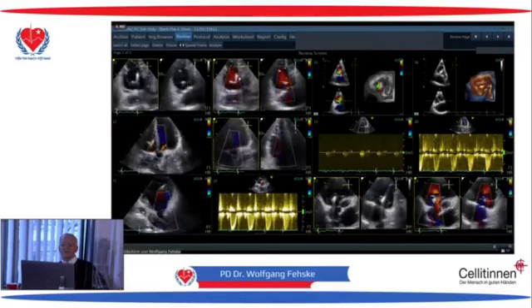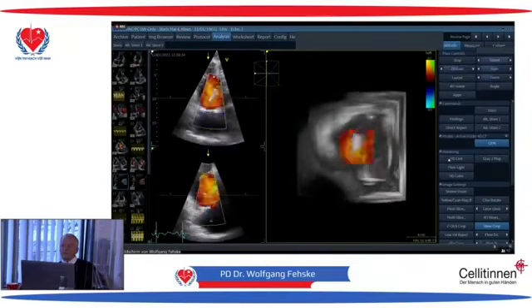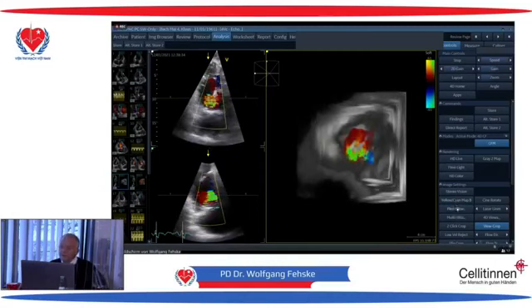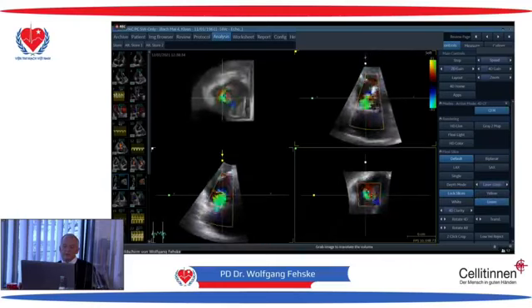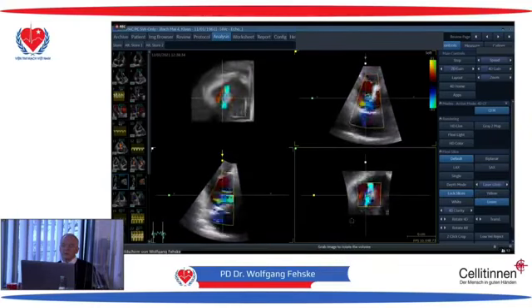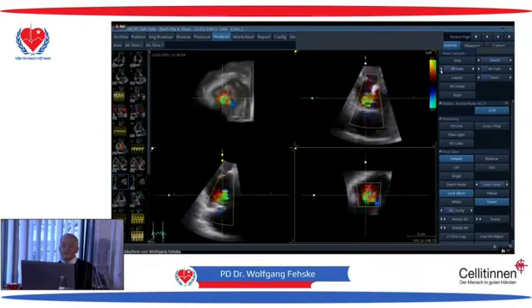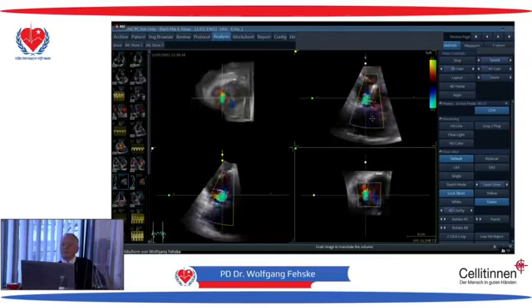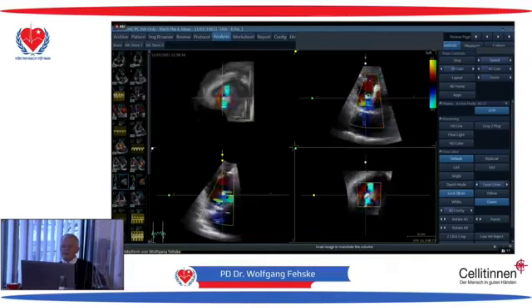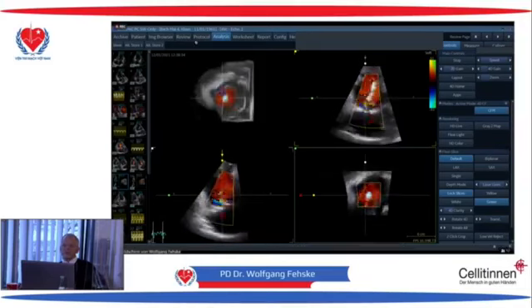You see in two planes here again what we had done before already. I show it here again. This is always the same flexi slides. You know, meanwhile, how we are working with it. This is the vena contracta. The pacemaker is still in place. And this is a very tiny regurgitation. This is still degree 2, but the patient has completely survived that, and his quality of life in terms of training status and so far is much, much, much better.